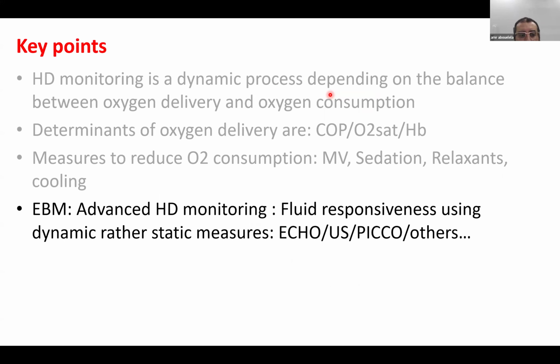And another key point of this presentation is that in advanced hemodynamic monitoring, fluid responsiveness should be assessed using dynamic rather than static parameters, either a clinical test or echo or ultrasound or PICO or whatever, but you should rely on a dynamic measurement or tool to decide whether to give fluid or not. This is a very important message.